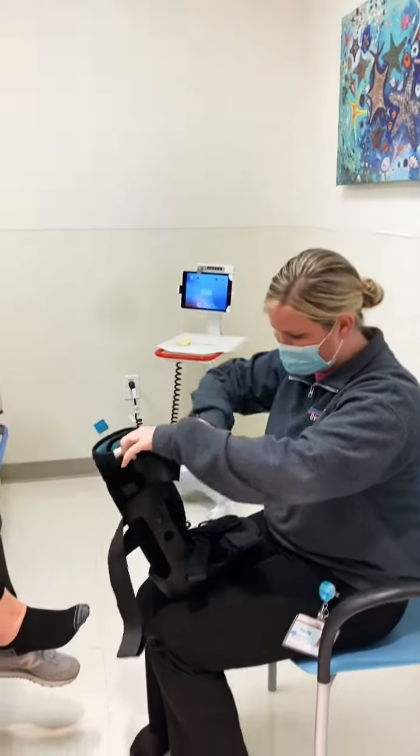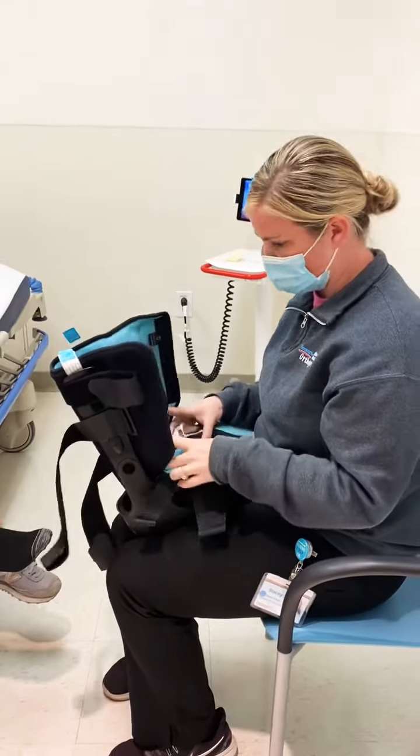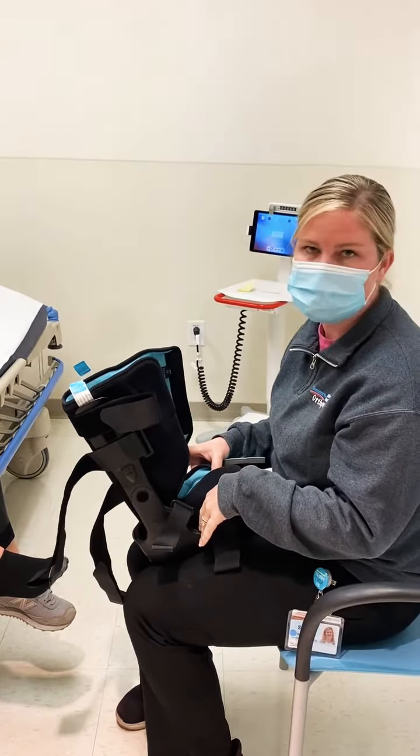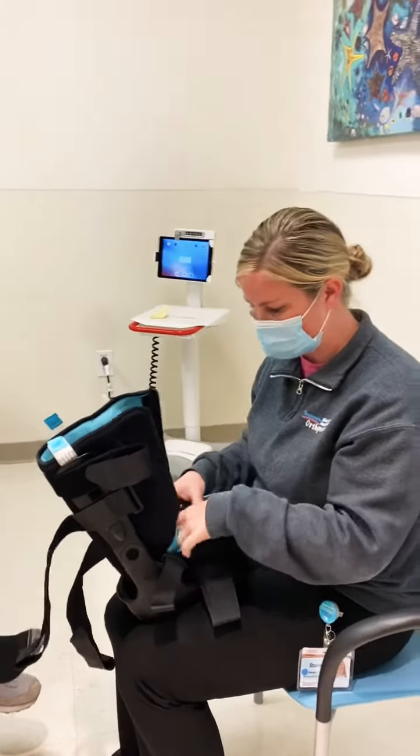This is a walking boot. They come in high and low boots, so the provider will let you know what height they want. Usually if it's a foot injury it'll be a low boot, and if it's an ankle or above it'll be a high boot, but they'll usually tell you which one.